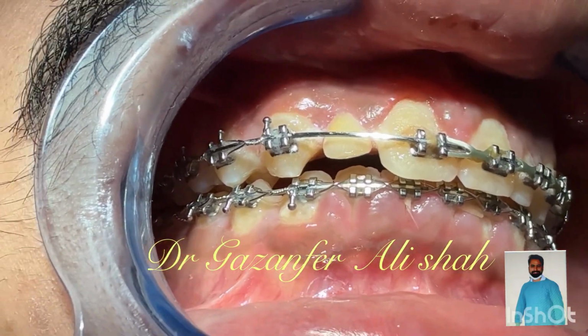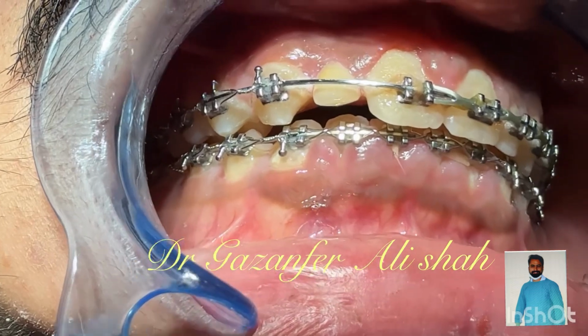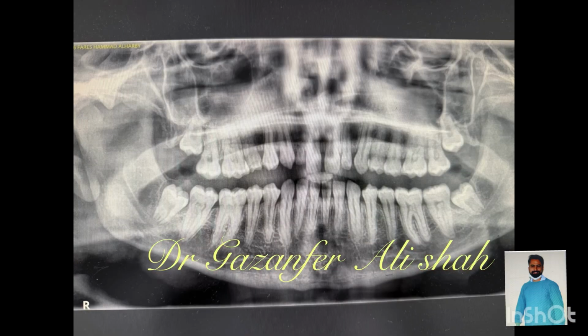Today I will be discussing with you the surgical steps of dental implant placement. I'm Dr. Ghazanfar Ali, practicing registrar at KSA.